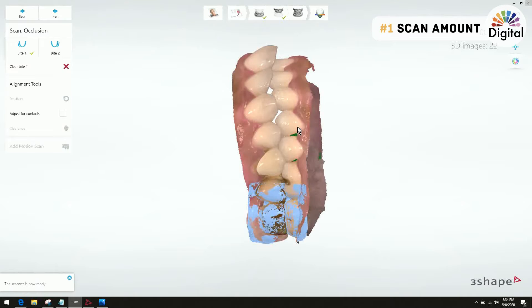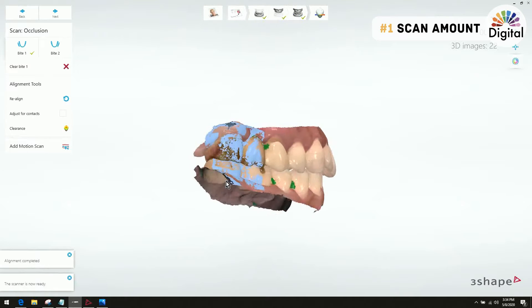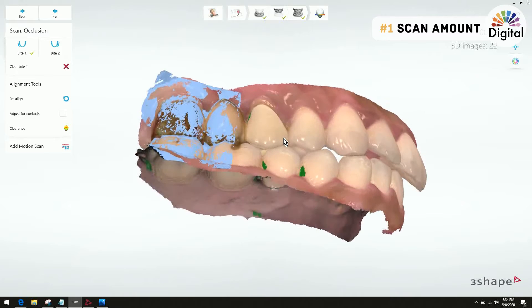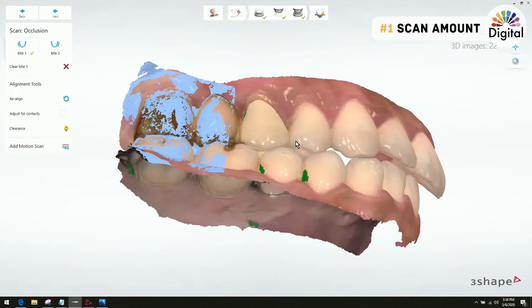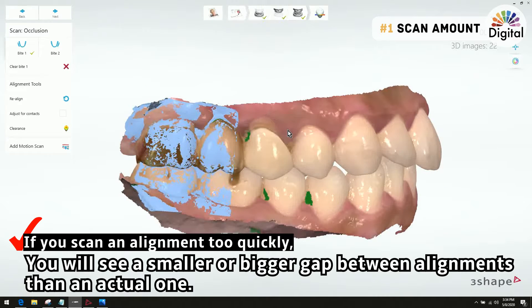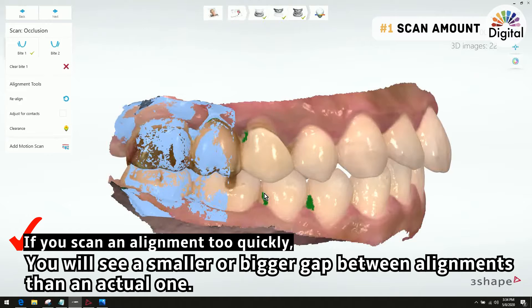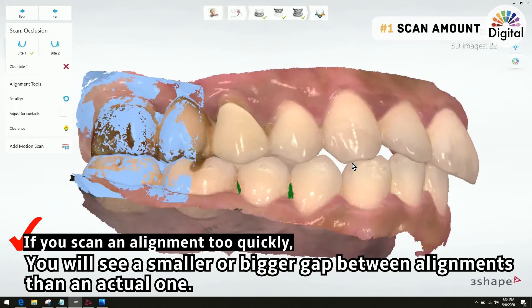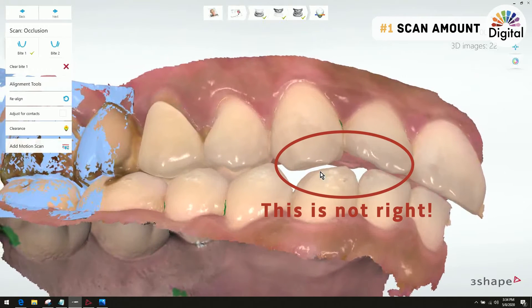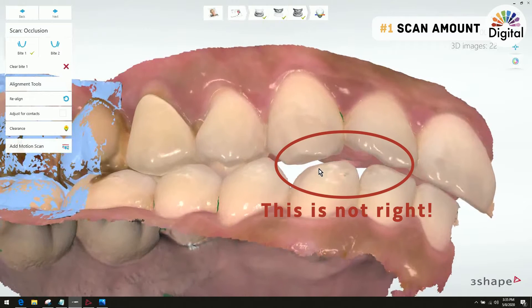I just scanned the bite scan for three seconds and the Trios software got automatic alignment done. It looks fine and looks good, but the point is: sometimes if we scan the bite scan too short — not enough data — even though the software shows automatic alignment done, it could make the alignment a little off, a little open, or a little too closed. For example, between my upper and lower canine I can see about a millimeter gap.